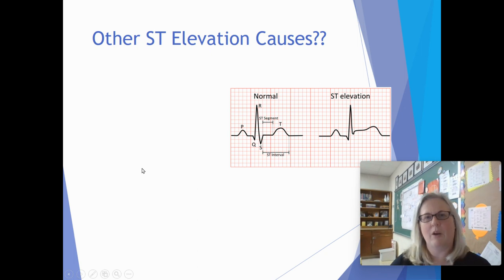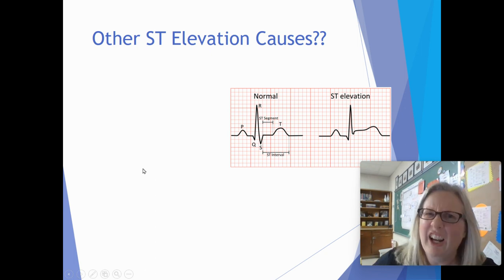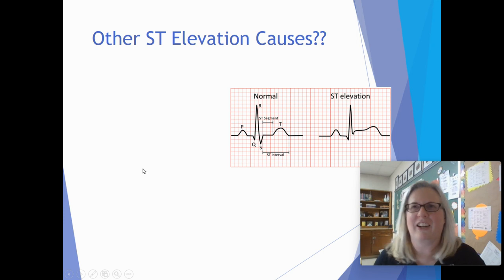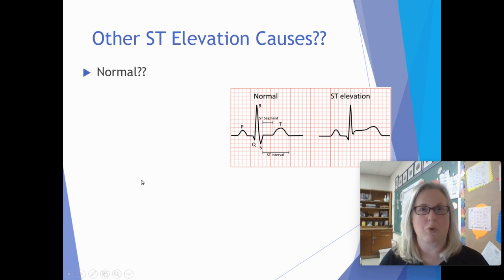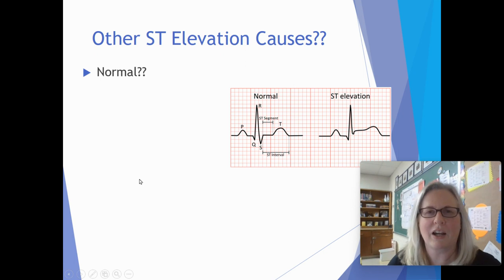All right. So there's other causes for ST elevation. I know it can't just be simple, right? There's another cause for it. Could this possibly be normal? It is actually occasionally normal in some patients. Yes, it is. Especially young patients, super athletes. It's called early repolarization, and we'll talk about that.